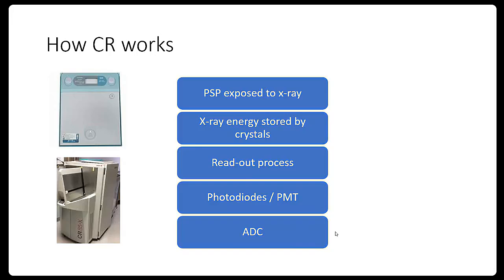I'll tell the process one more time. Firstly, we'll expose the PSP plate, that is this PSP cassette, with the help of X-ray, and after the exposure is done, we'll take the PSP cassette to the readout process. The X-ray energy is absorbed by the PSP crystals and stored within them. Since the crystals got some energy, the outer shell electrons jump into a higher level.